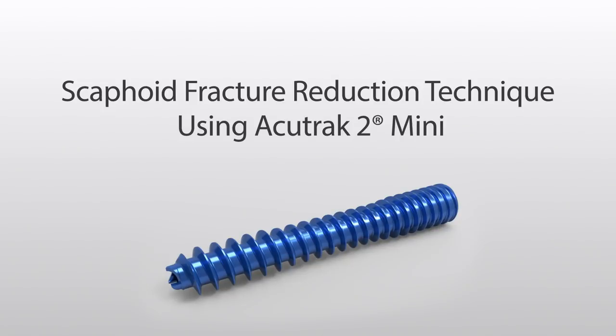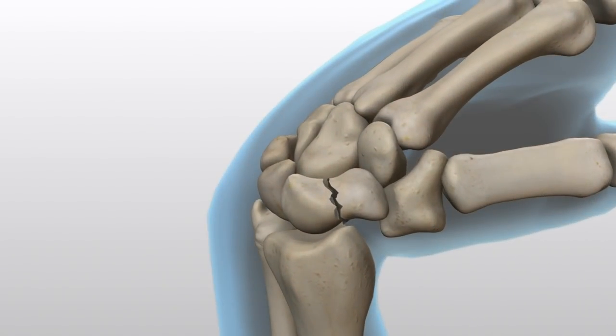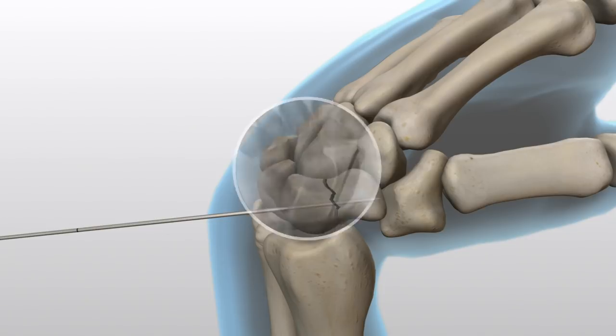Scaphoid Fracture. Reduce the fractured scaphoid and secure it using a 0.045-inch guide wire at the desired screw placement location through the central scaphoid axis to the far cortex. Confirm wire placement and depth under imaging.